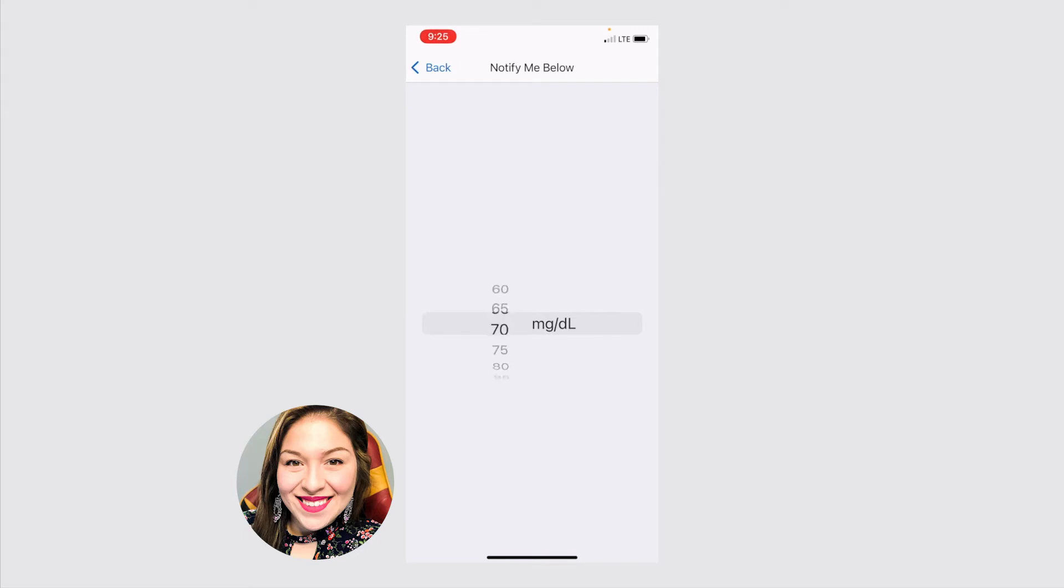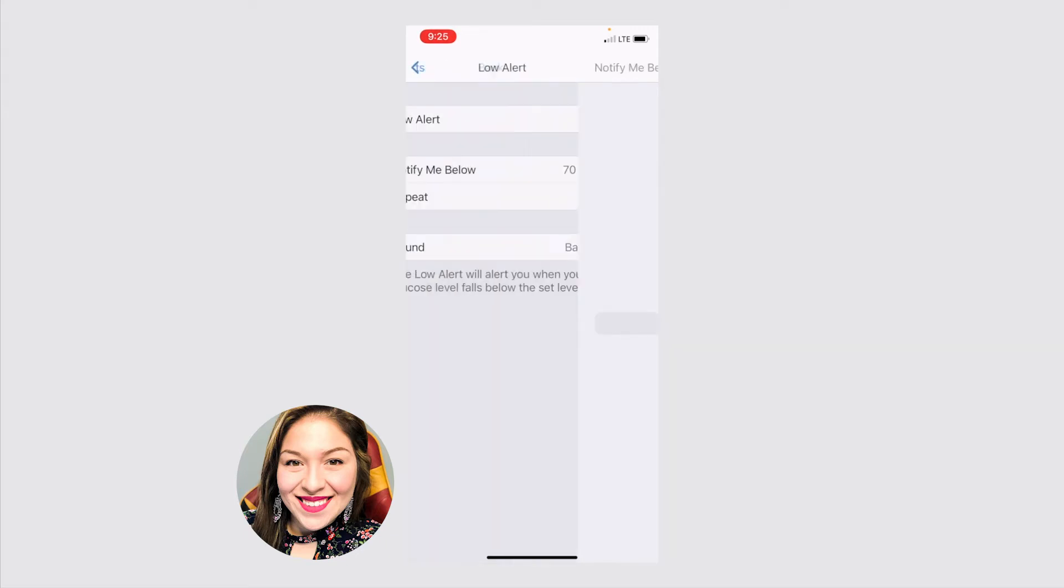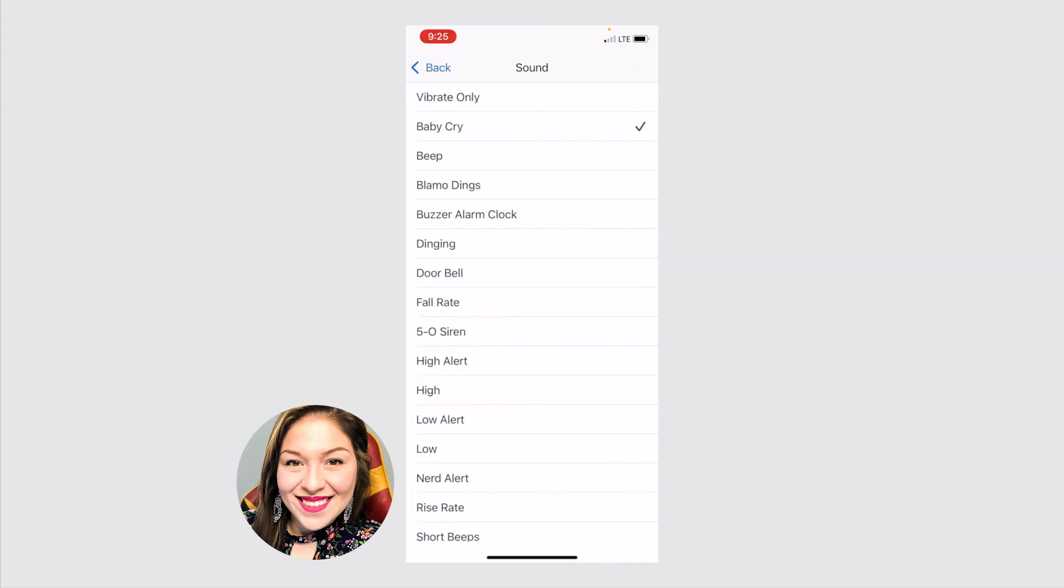I'm going to put mine back to 70. And you can also change the sound so you can make it as annoying, as loud, whatever will help you actually hear.